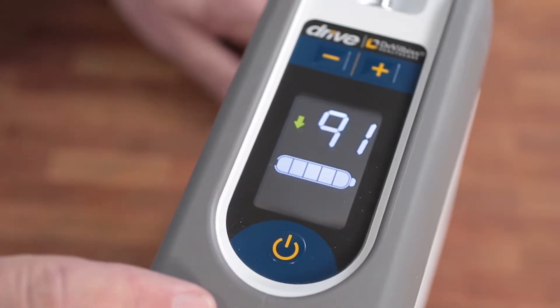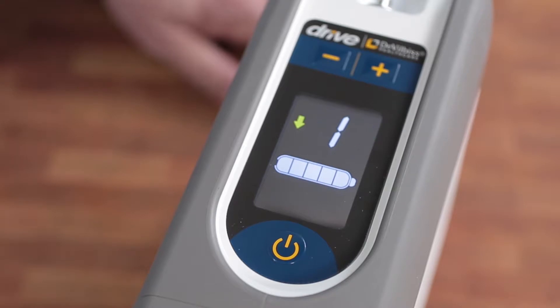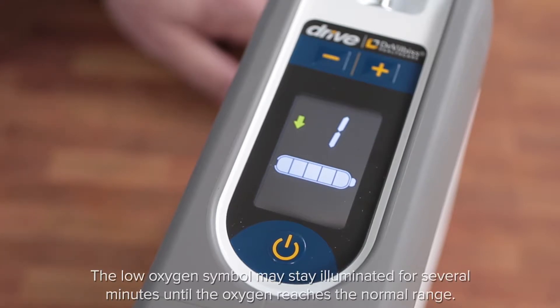When starting up your iGO2, the device will beep and briefly illuminate all symbols on the display control panel. The text on the control panel acts as a self-test that will automatically run through to ensure the functionality is operating correctly.